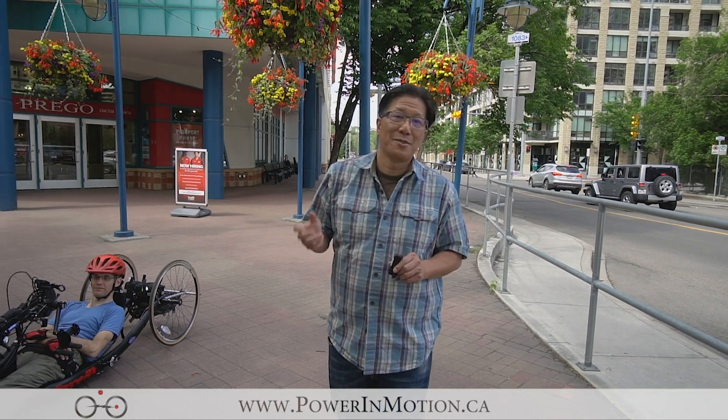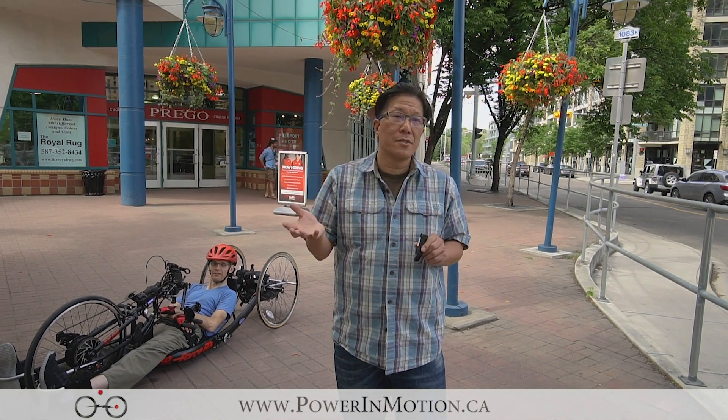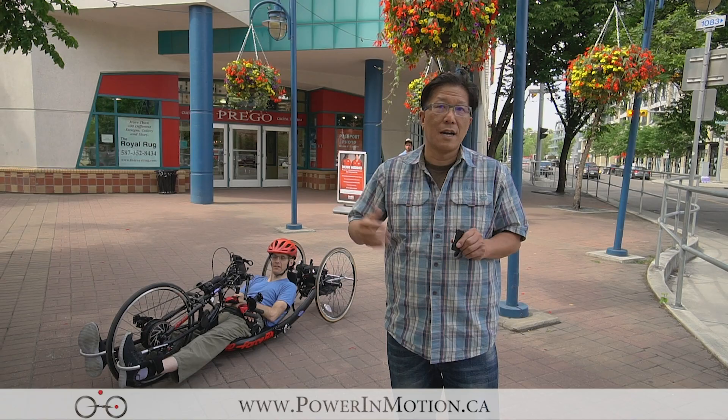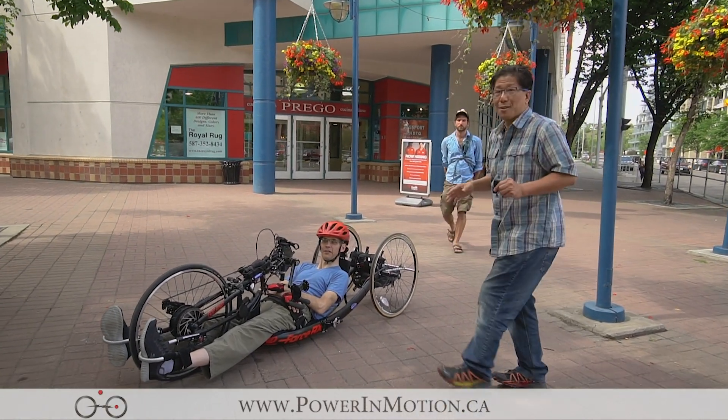Welcome to PowerMotion YouTube channel. Today this video is slightly different than all other videos that we have made. We're doing a conversion kit, but not any e-bike conversion kit — we're actually converting a hand cycle here. Let me show you what the hand cycle looks like.